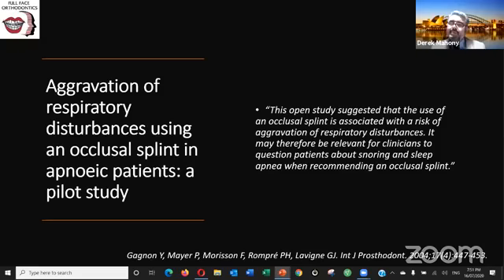That's retro positioned. They look like a class 1, but everything's just too far back against the back of the throat. As soon as you start to do something like that without advancement in a patient like that, well, it's all over. So determining that a patient could have an airway problem before you give them a splint means that you might actually make them a mandibular advancement splint instead of a normal flat plane splint.